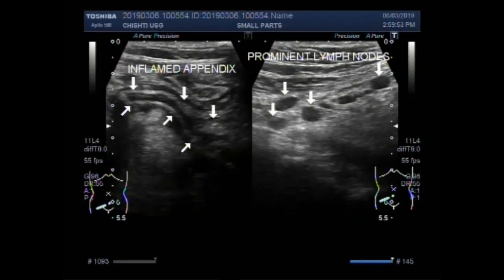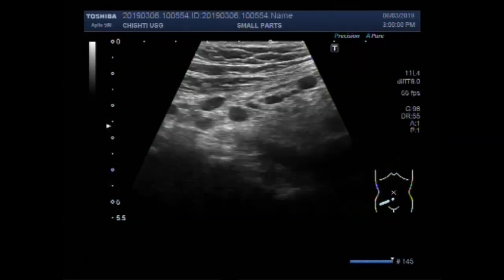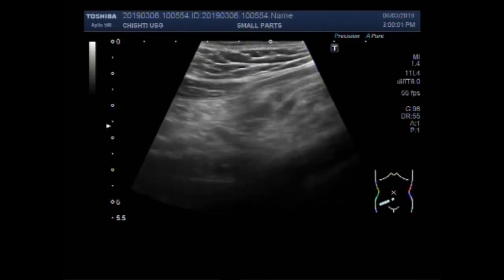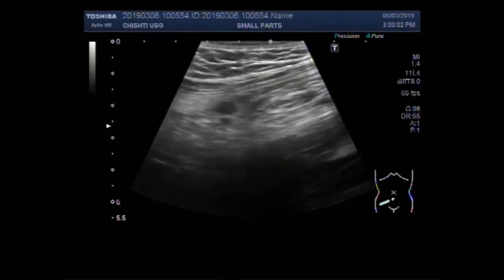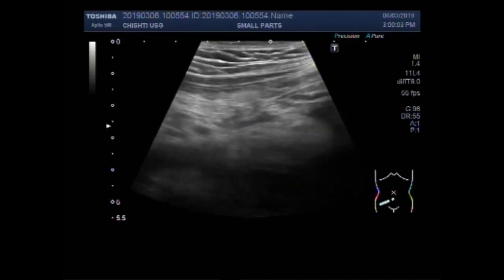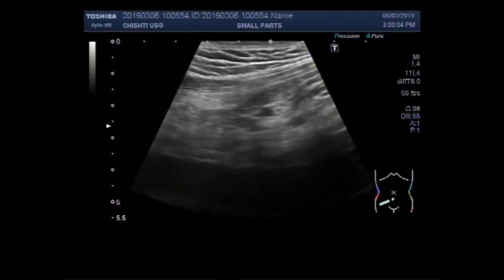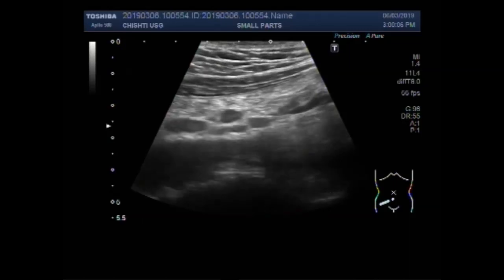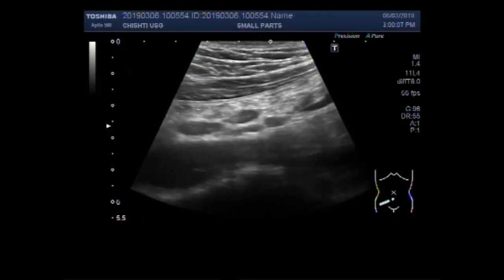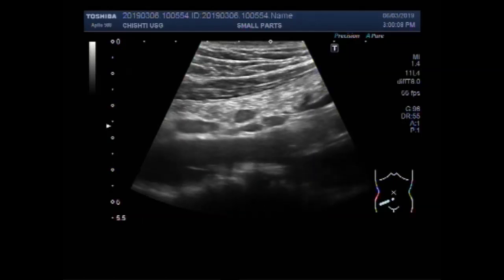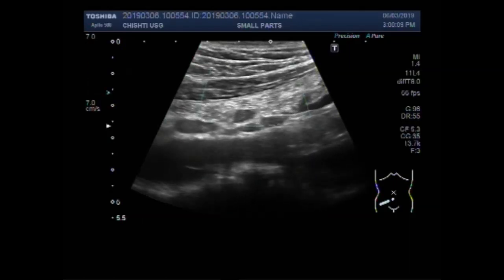Dear viewers, I hope you are all fine. This ultrasound video shows a case of inflamed appendix with prominent lymph nodes in the adjacent area.